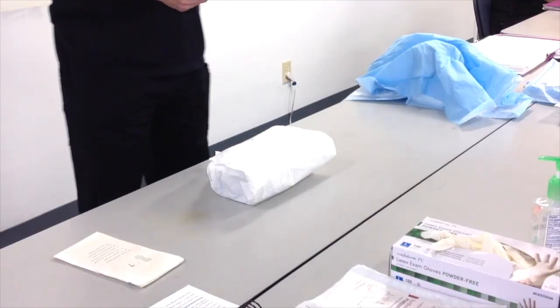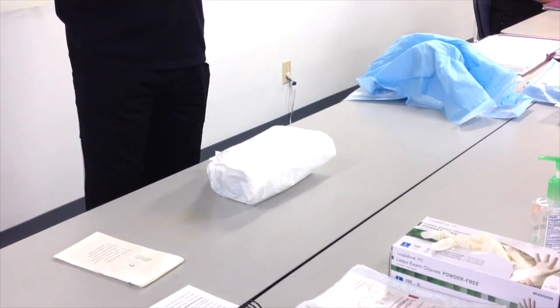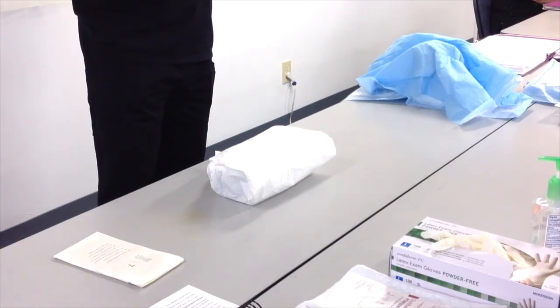The mannequin may have an ID on it. The CE may have an ID. It depends on your testing site. One or the other, there will be an ID band for you to identify this patient. And it is a critical element. You must identify the patient. As long as you don't start the process, anytime before that, you can identify the patient. Does that make sense? You could identify them, then wash your hands, or wash your hands, then identify them. As long as you haven't started opening things up and getting ready to cath the patient, you will satisfy that critical element.